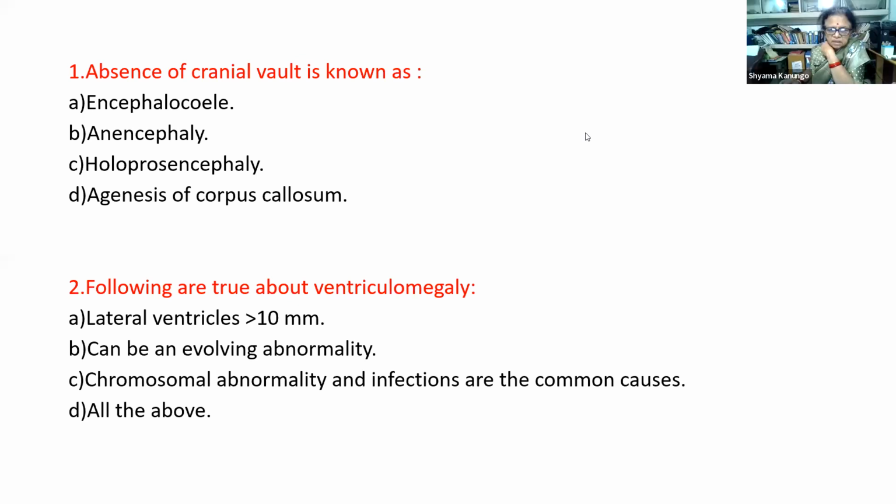There's a variety. Just a marginal increase in the ventricles is another variety where the outcome is not so bad. I would like Professor Khurana to talk about that, because some of them may find just mild, moderate, and severe. Sir, please tell us about mild, moderate, and severe, and what should be our approach to mild ventriculomegaly.